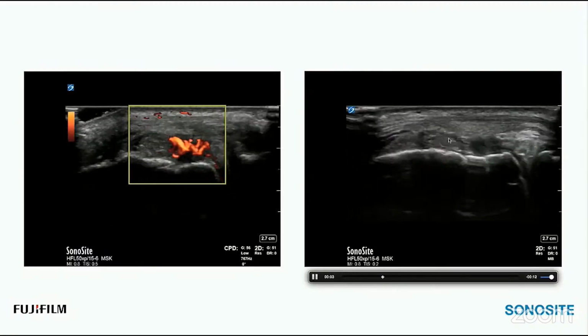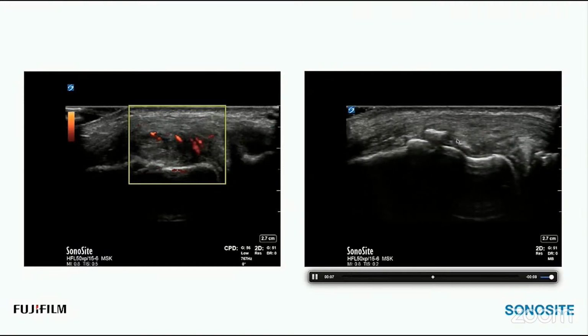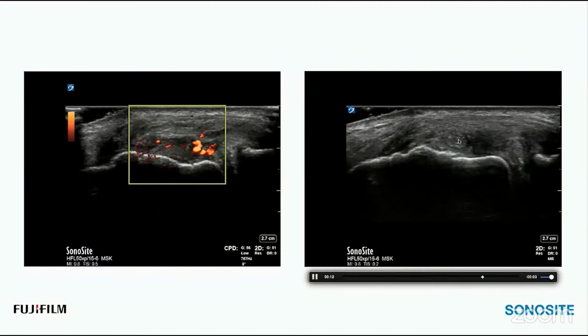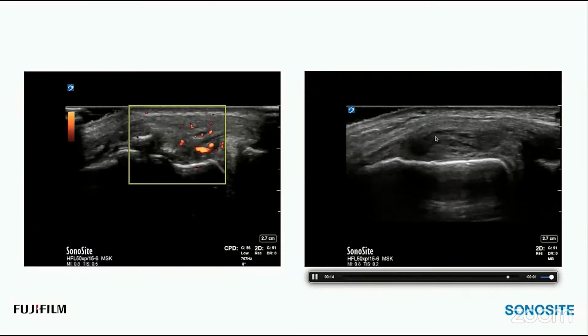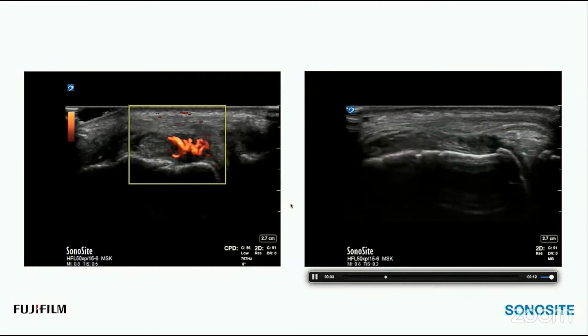And you can see that these ligament fibers are just giving way and causing all kinds of calcium deposits in here. And there's even some free fluid in between a lot of these fibers right here. So just something to be on the lookout for when you're scanning these diagnostically. It's a lot of fun when you do find something.